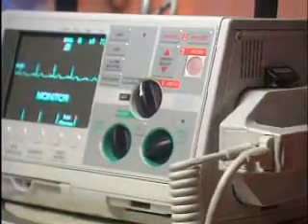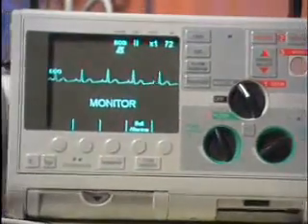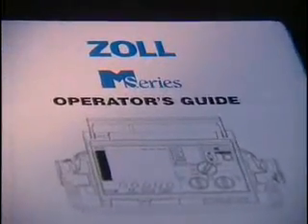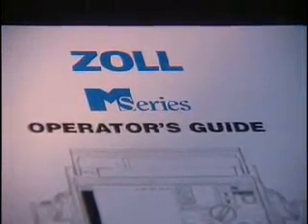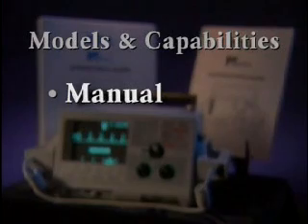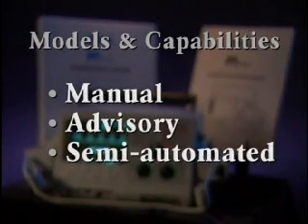This program will introduce you to the Zoll M-Series and its features. To fully understand its operation, you should read the operator's guide and your medical control authority's protocol for use. The Zoll M-Series is designed for use by health care providers trained in manual or automated defibrillation. Models include manual defibrillators, advisory models, and semi-automated models with manual override.